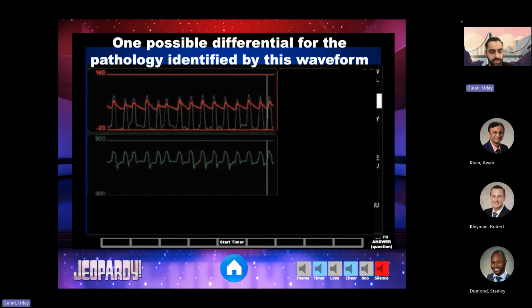So what I'm trying to allude to is you see those big green spikes, those negative deflections in the motor waveform? That's what I'm trying to point to. And so you're getting these sharp decreases causing negative pressure. Unless anyone has the answer, I'm going to move forward.